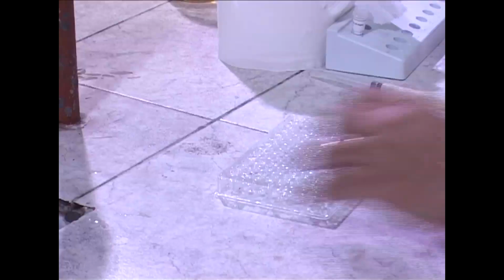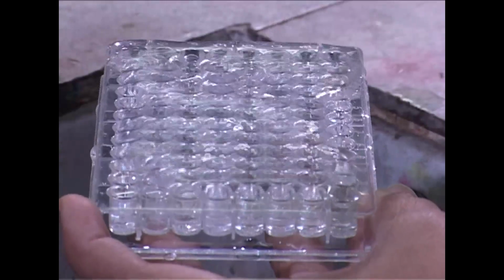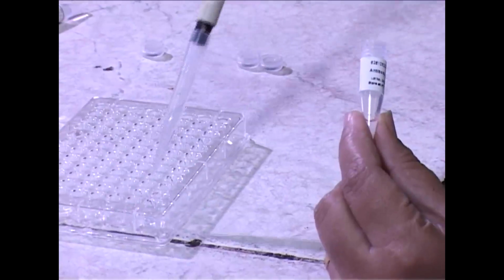In the next step we will add the sample. If the sample is carrying specific antibodies against this antigen, they will bind to the antigen. We have to then again wash the wells so that excess or unbound antibodies are washed off from the wells. Next, we will add an enzyme tagged secondary antibody specific for the primary antibody used here.